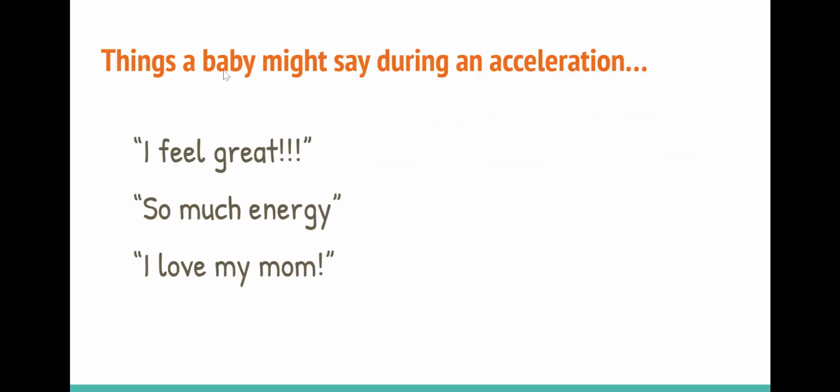Things a baby might say during an acceleration. I feel great, so much energy. I love my mom. That's what a baby's saying during an acceleration.